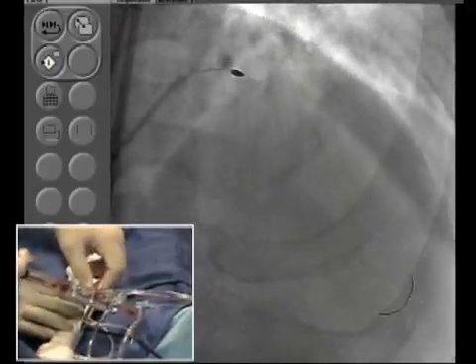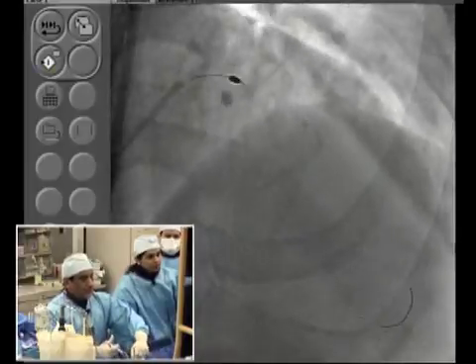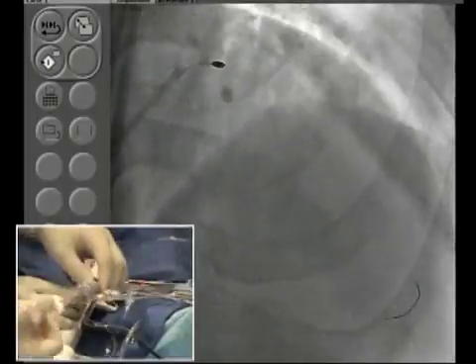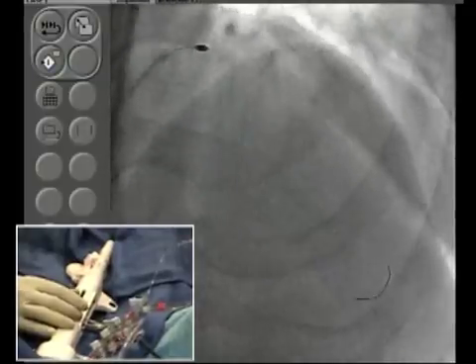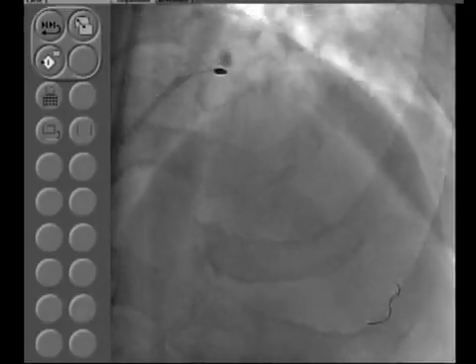Now another thing we can do, if you see that you do it a few times and it doesn't go, you can increase the speed up to 160, because clearly, according to David Auth, ablation efficiency does go down at a speed of 140. So after 4 or 5 runs, before downgrading the bar, we'll try to go to 160,000 RPM. That was actually the original recommendation with the FDA when the device was introduced, but we have all gone to a smaller burr now.